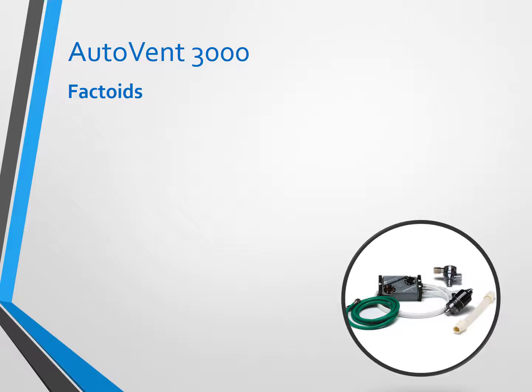A few thoughts about this. The AutoVent is simple — simple to put together and simple to operate. It does meet all AHA standards, and it can be used either in routine transports from a nursing home or facility to the hospital, or in an emergency setting.